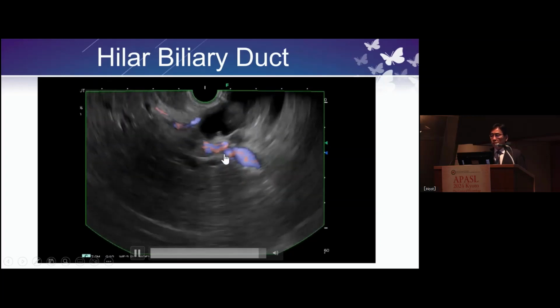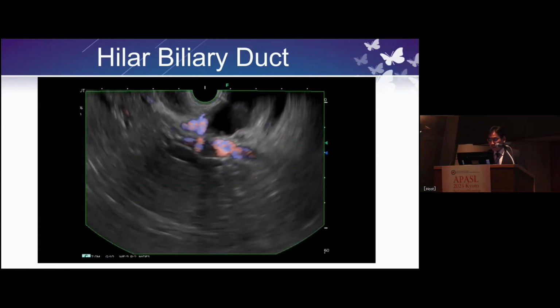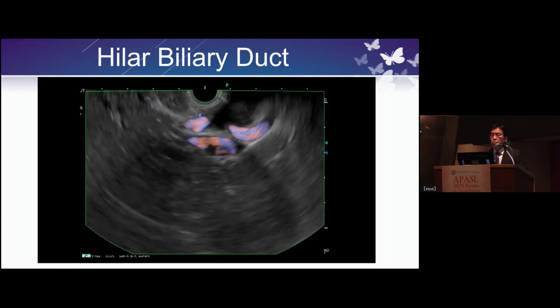Quite simple. So I mentioned again, this technique is just visualization to understand the anatomy. If you want to puncture or if you want to perform intervention, you need more clockwise rotation or something.